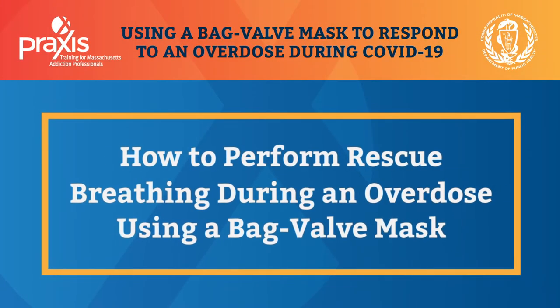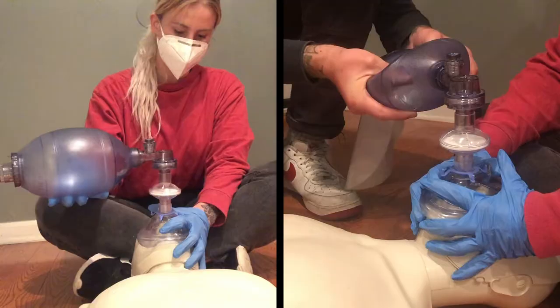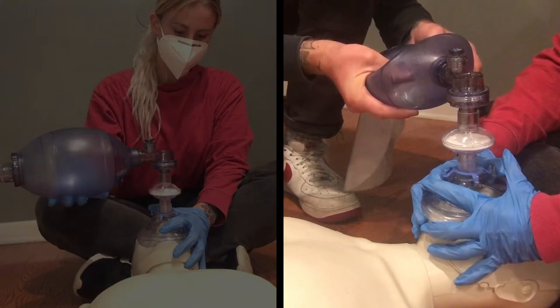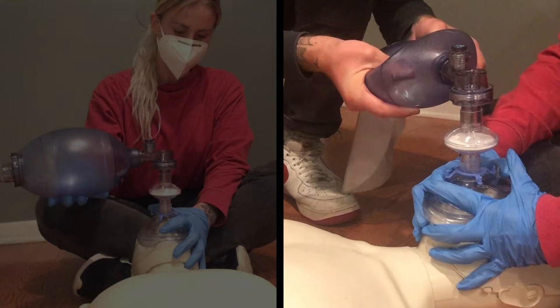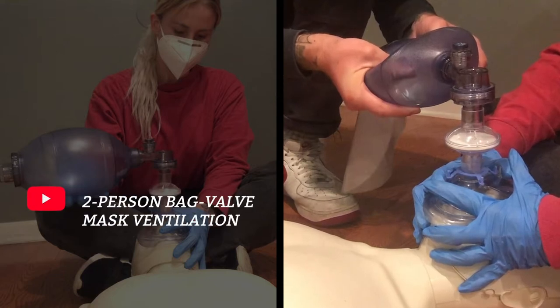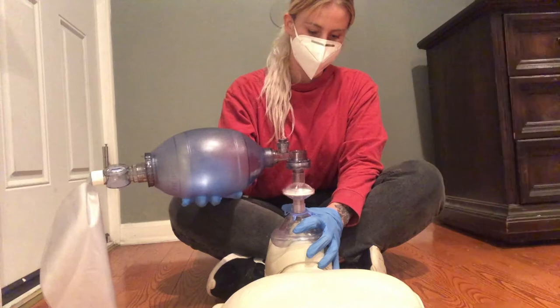How to perform rescue breathing during an overdose using a bag valve mask. Bag valve mask ventilation can be done with one person or two, but two-person bag valve mask ventilation is easier and more effective because it helps to have two hands on the mask so you can keep a tight seal. Check out the video in this series, Two-Person Bag Valve Mask Ventilation, for tips if you do have a second responder. This video covers what to do if you are responding to an overdose alone, and you should watch it for the full process even if you have a second responder.